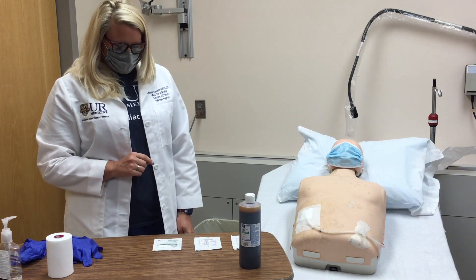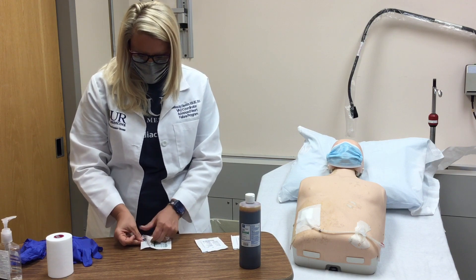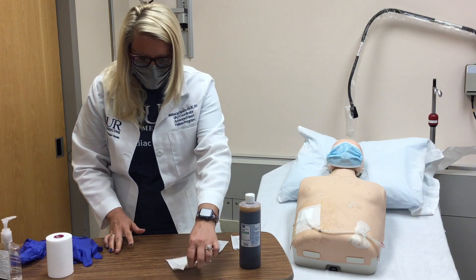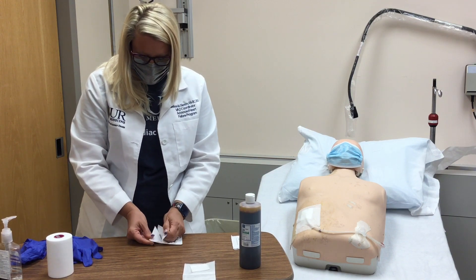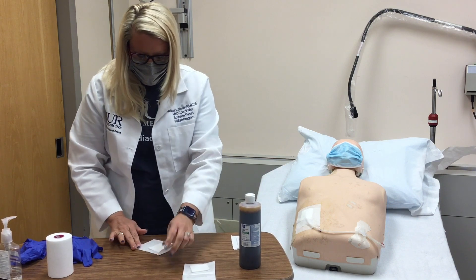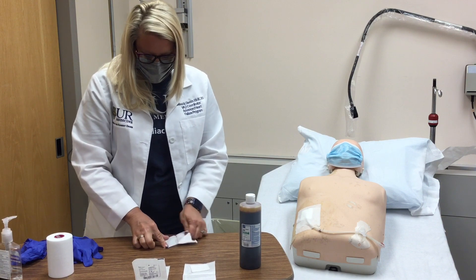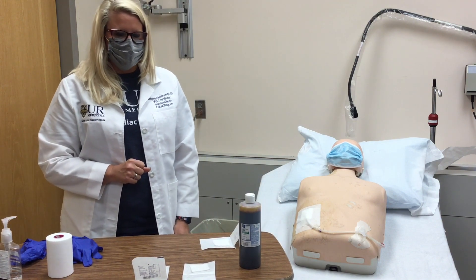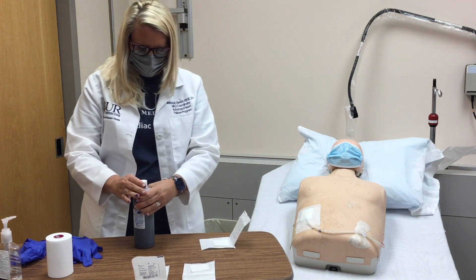Open the split gauze packet and the two gauze pad packets. Next, we are going to open the bottle of betadine and pour a sufficient amount onto both gauze pads.